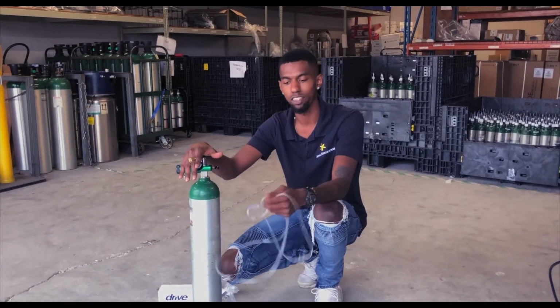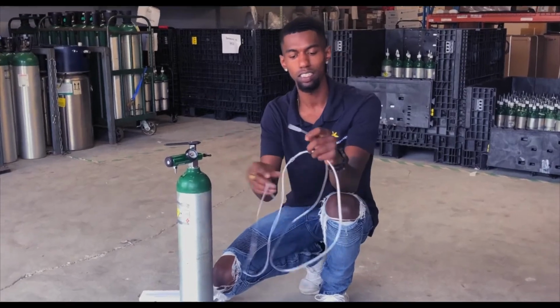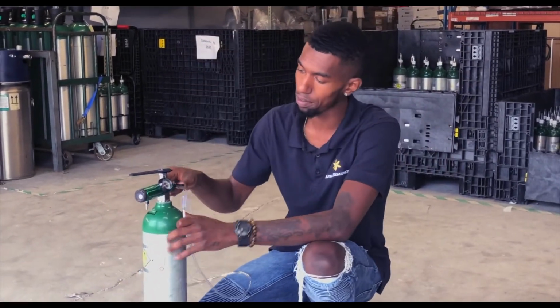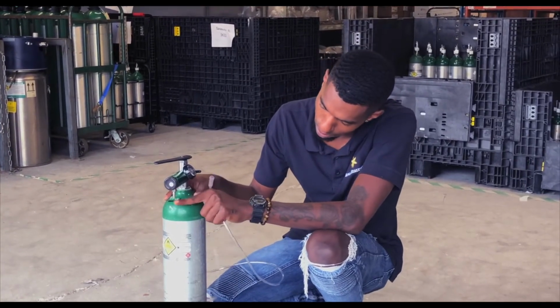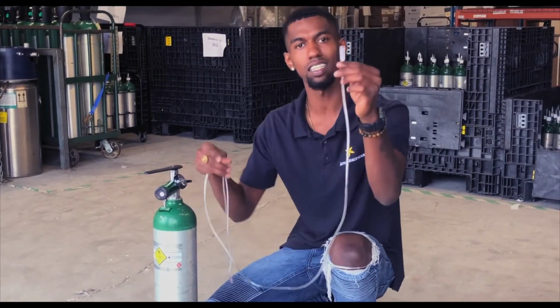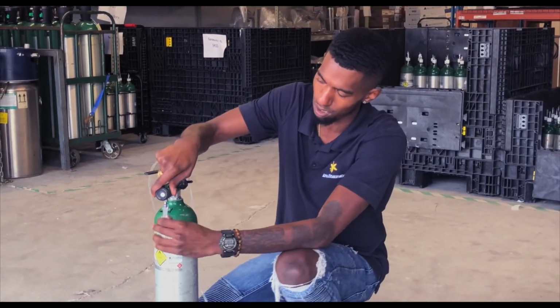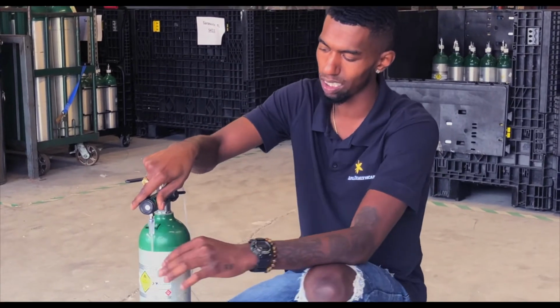Now we just need to figure out how we're going to get oxygen. So you're going to take your cannula. Hopefully you have a cannula. And you're going to look at your regulator. And if you notice, you have a brass piece, metal piece that sticks out almost about half an inch. You're going to take the end of your cannula and connect it, push it up, snug but not too snug, not too tight, just like that.